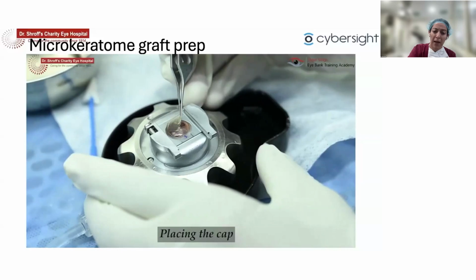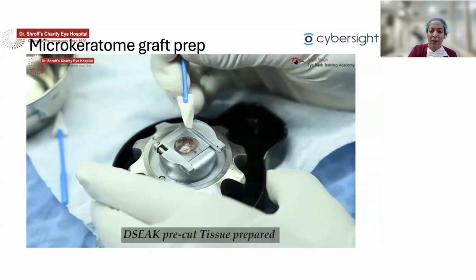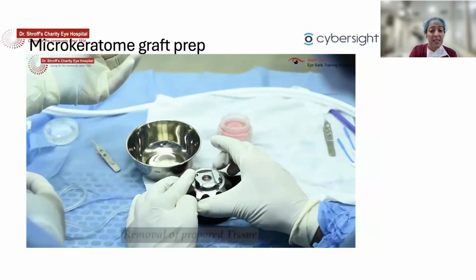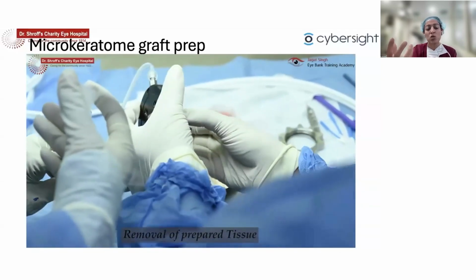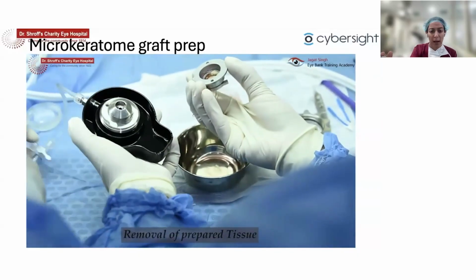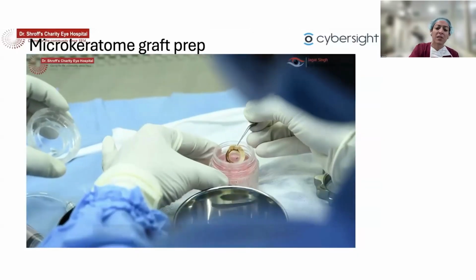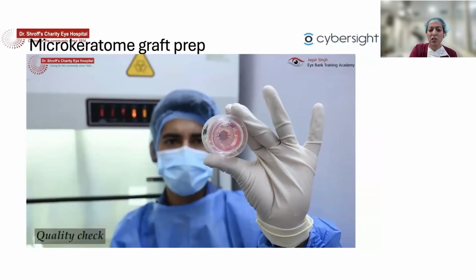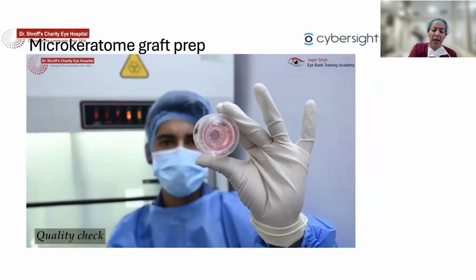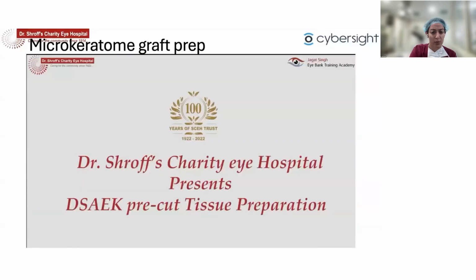The cap is dried, the bed is dried, and the tissue is placed back in place. It's very important after this step, when you release the tissue, that adequate fluid is pushed to release the tissue because at no time you want the tissue to collapse because collapse of tissue will cause endothelial cell damage. The tissue is then placed in the cornea viewing chamber. Quality check of the tissue is done, which will include the endothelial evaluation, and then the tissue is ready for usage.